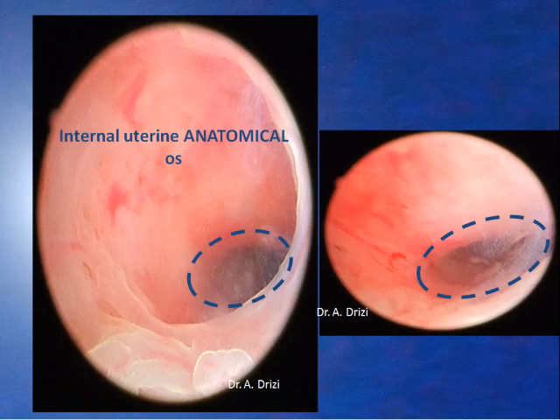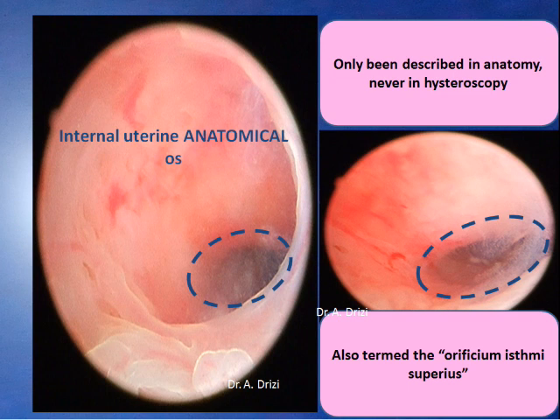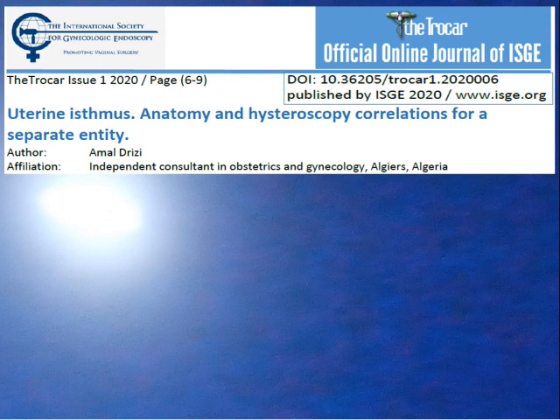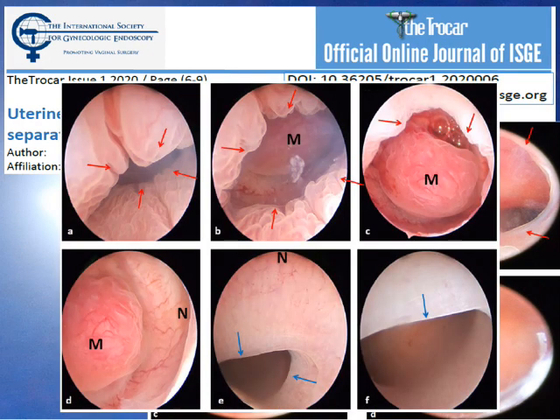The anatomical ostium has only been described in anatomy, never in hysteroscopy. It is also termed the orificium isthmi superius. In an article published in Trocar's first issue in December 2020, this fourth ostium is demonstrated for the first time in the literature, thus clearly delimiting the uterine isthmus as a separate entity.